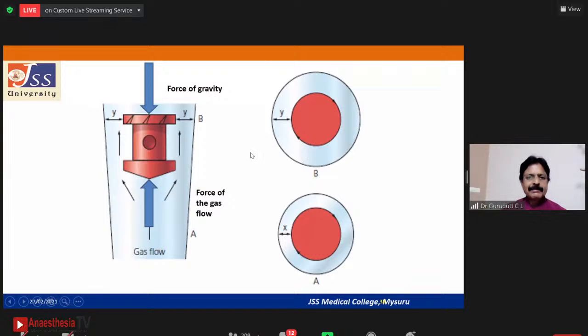And the second thing they may ask you is why the bobbin rotates. This is again because, at the top of the bobbin, you have the slanted flutes. When the gas flows, the gas is going to hit these slanted flutes, and once it hits them, it makes the bobbin rotate. So that is very important.